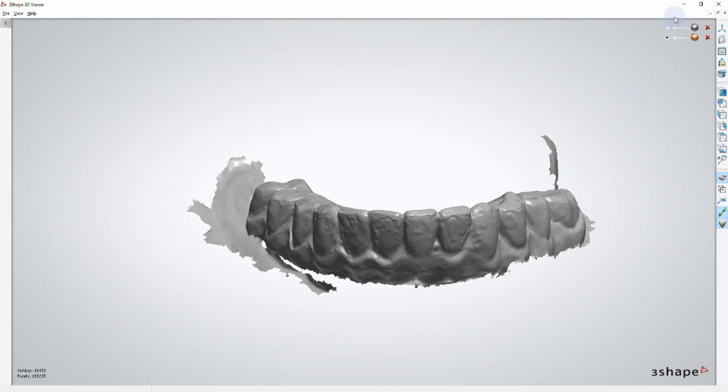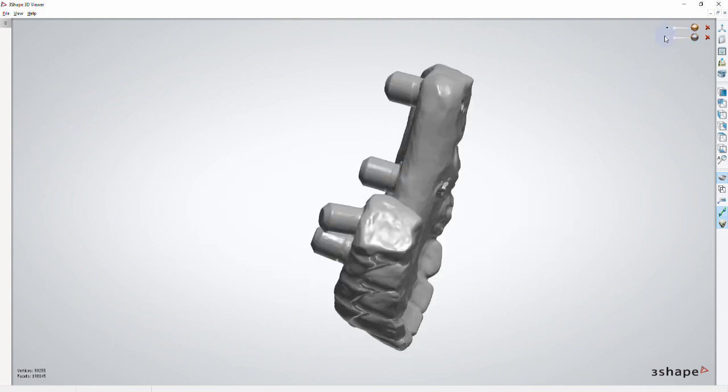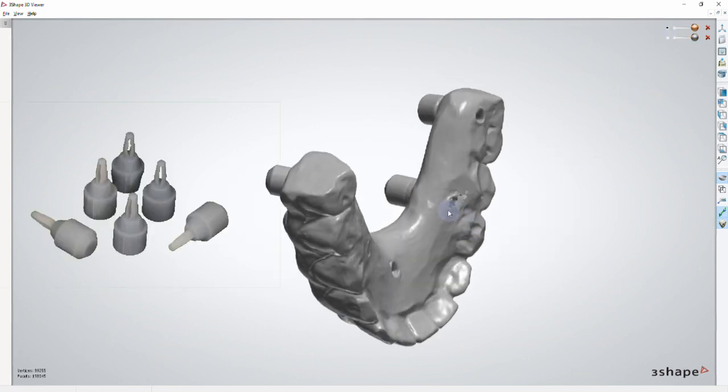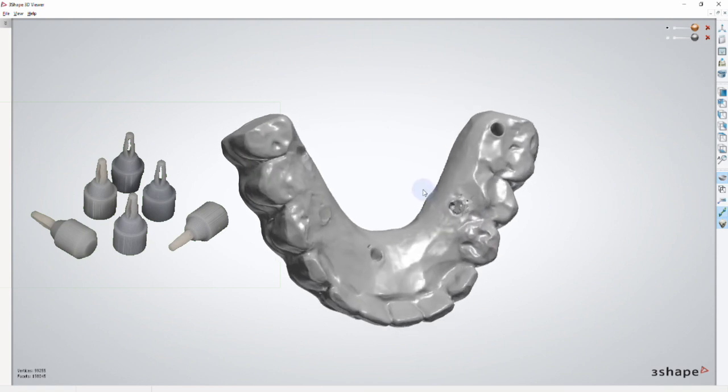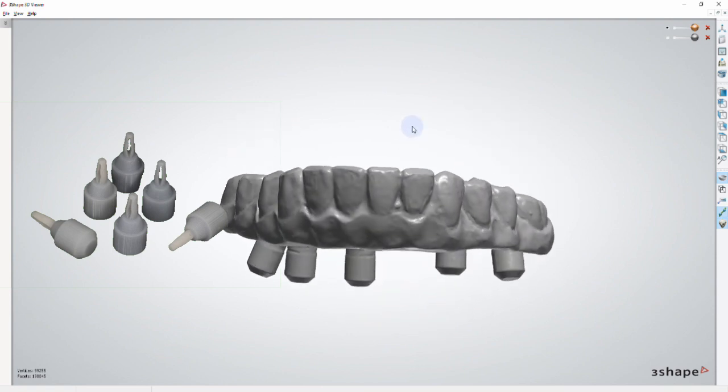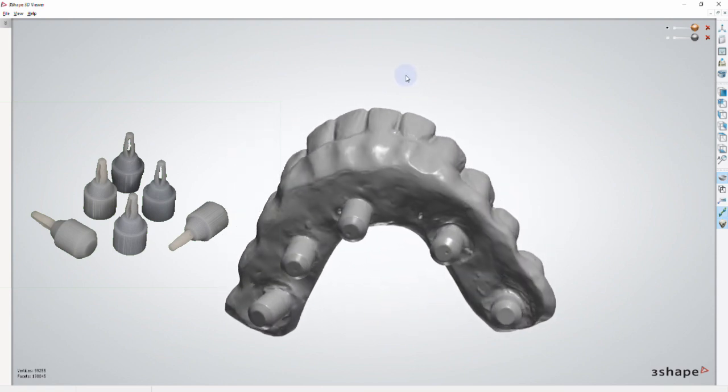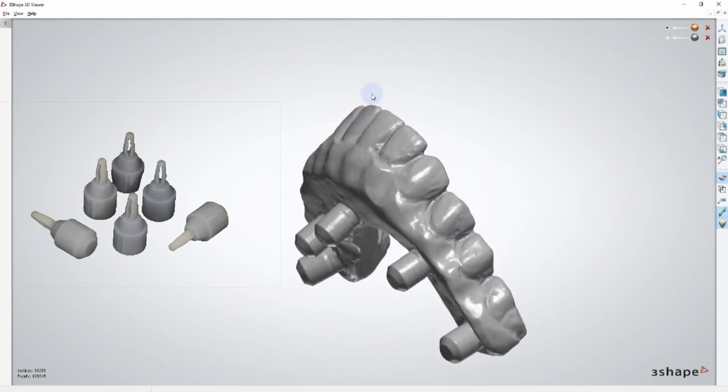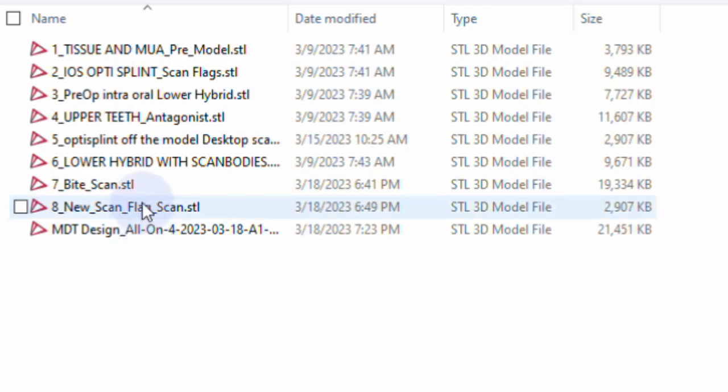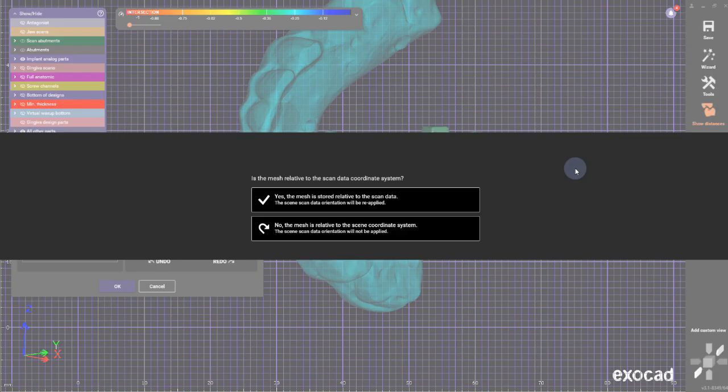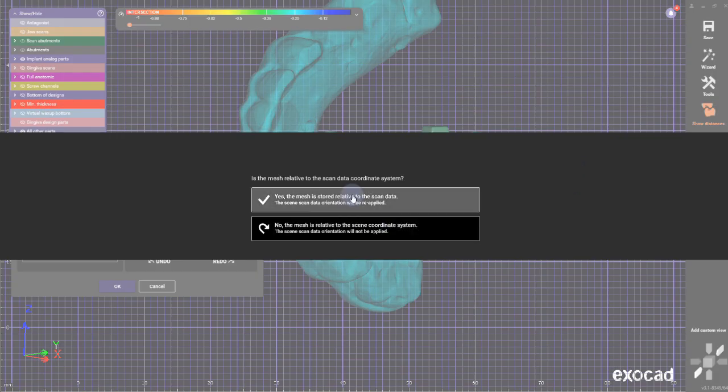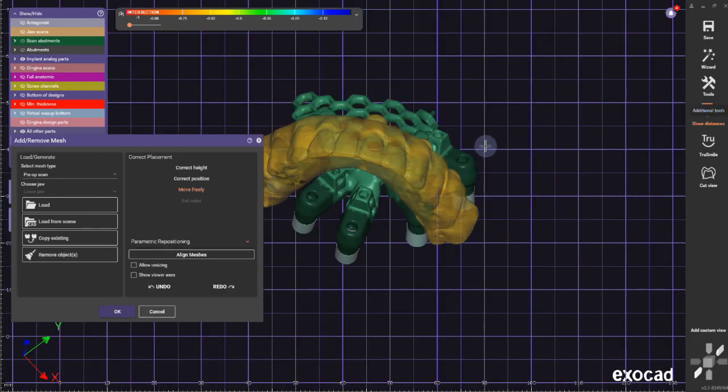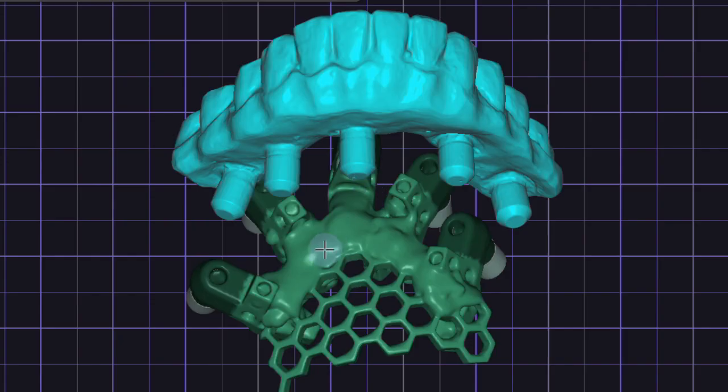But what if you don't have a scan like this? You can take these little scan flags, pop them into the multi-units, and scan the entire prosthesis inside out. Then you're going to load it into your Exocad scene and align these scan flags to the scan flags of the Optis splint.